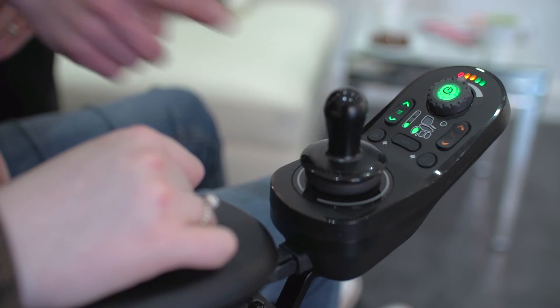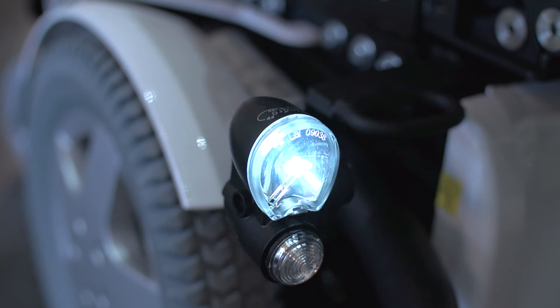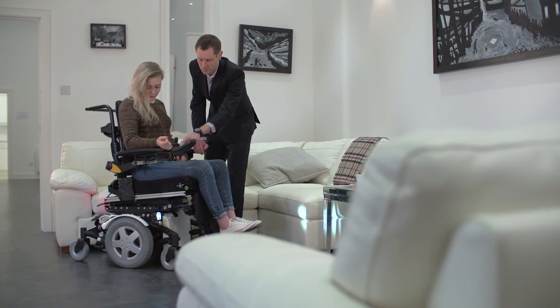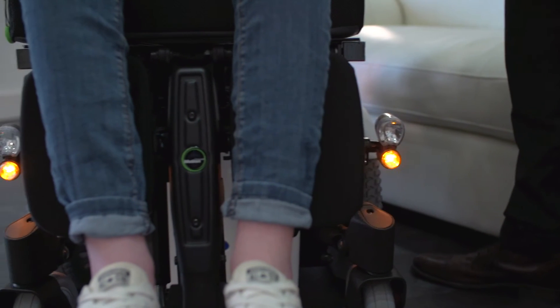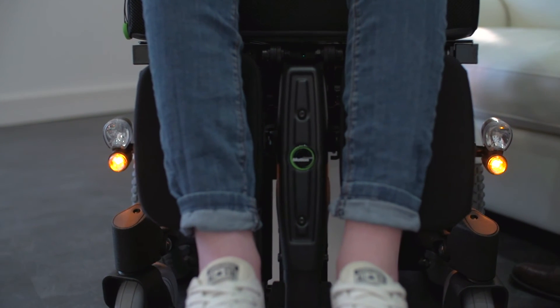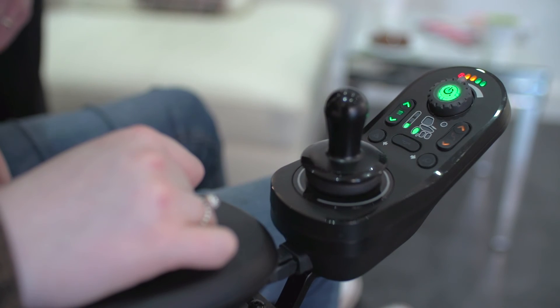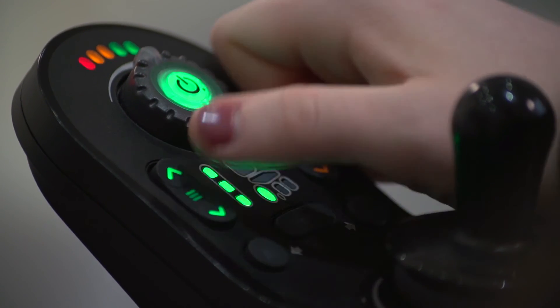For lighting, a short press on the right hand side button activates the side lights, and a long press on the right hand side button activates the right indicator. A short press on the left hand side button activates the left indicator. A quick press turns off the last function. The lights have been designed so the more frequently used functions are quicker to access.